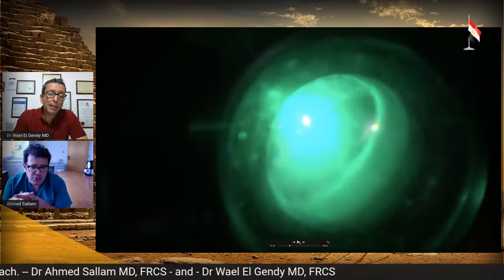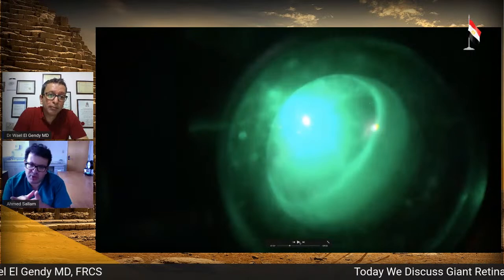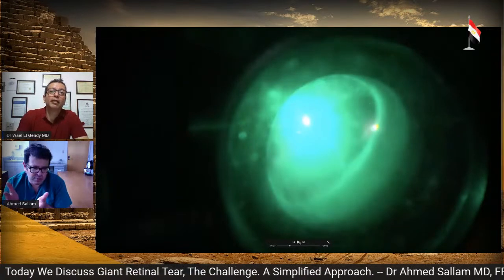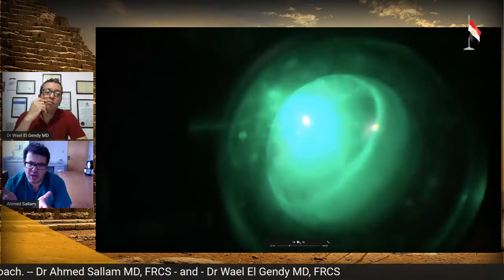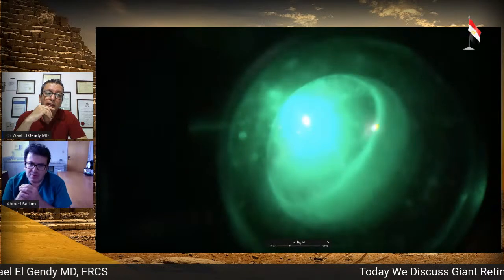If I cannot reach them with illuminated laser, especially in phakic patients, usually you can do cryo. It is a very good idea, and a little bit of cryo is actually very good. It's not going to cause much PVR. Too much use of cryo is not good, of course. And you don't need an assistant. But very important, as Dr. Wael is saying, to treat the horns.